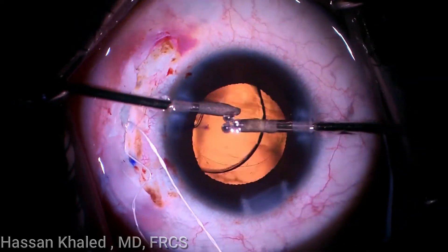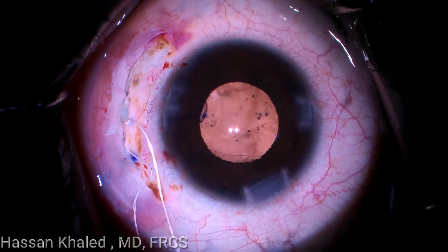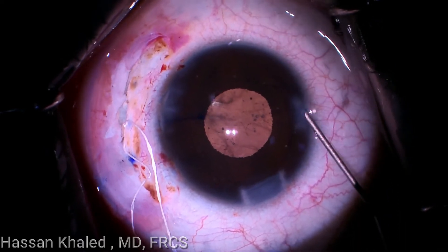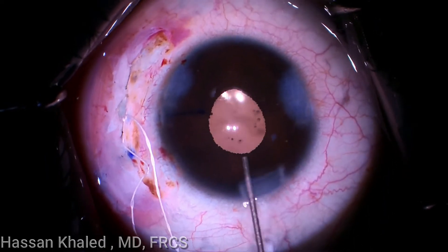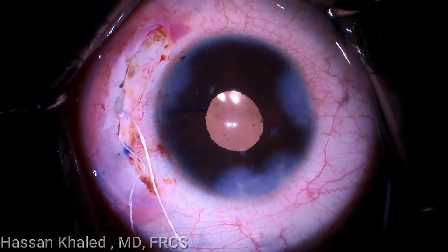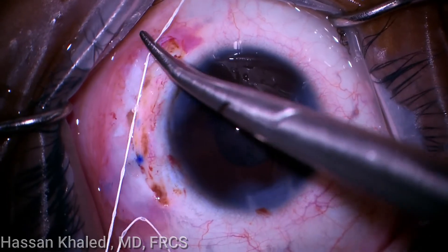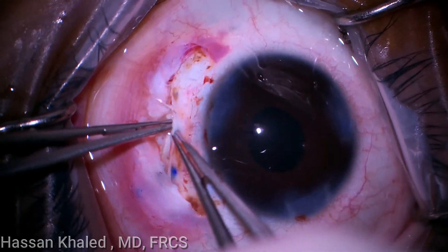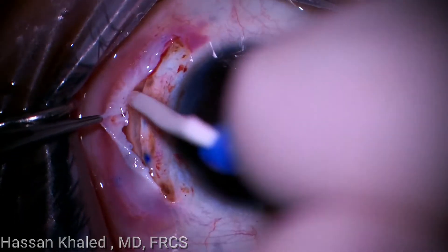Then Miochol is injected to constrict the pupil, resulting in a well-centered IOL with a beautiful round pupil. The suture is then tied again securely and the knots are hidden through the scleral pocket, which is closed using vicryl suture. The conjunctiva is also closed using vicryl suture.